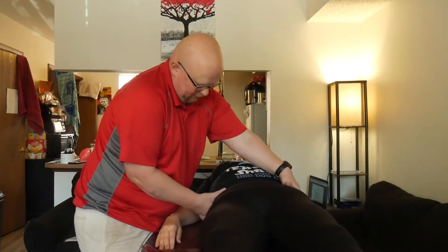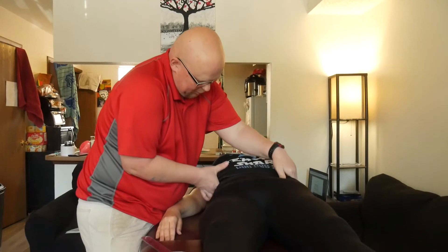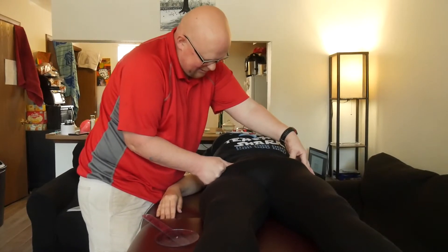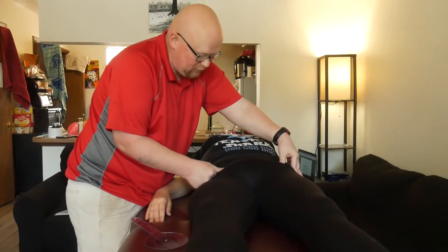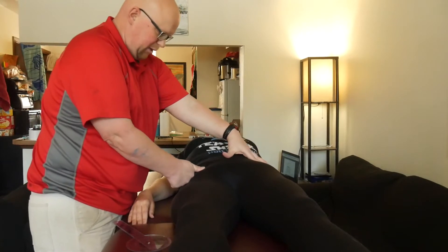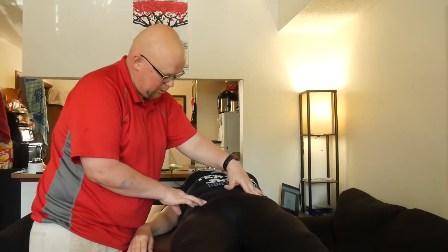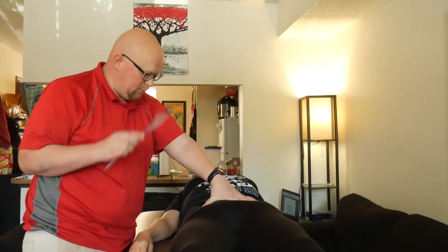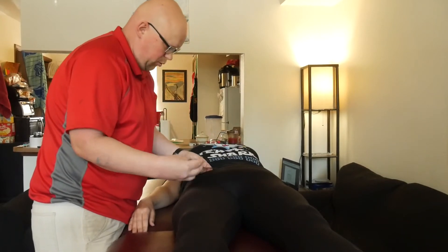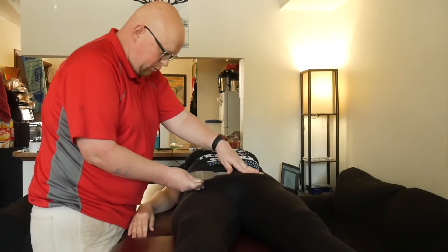You can find those by just finding the spine of the ilia, your iliac spine here, and then just follow it down. As you come down around, you'll hit the spot where it's the highest and then it will drop off. Once you've hit the drop off, you've gone too far — back up just to that little bump. They should be pretty much aligned unless they've got pelvic misalignment, and that's something we'll learn how to fix in Therix. So here are those for her. One of your fulcrums starts here on one of them, and then your proximal arm will go right across to the other and will point right over it.